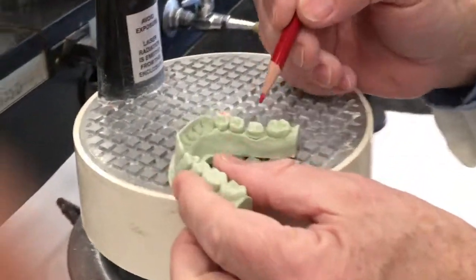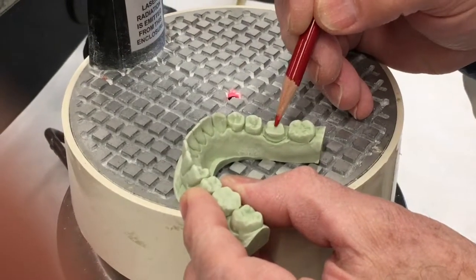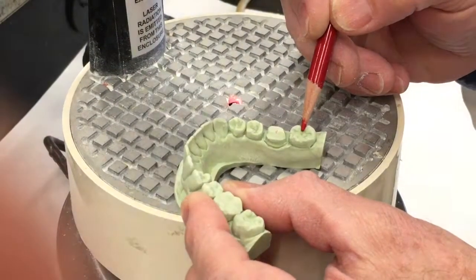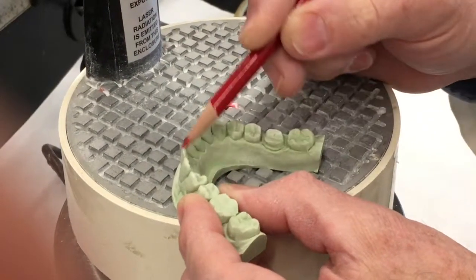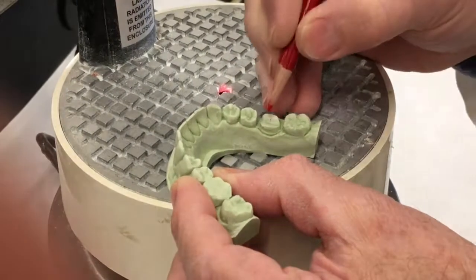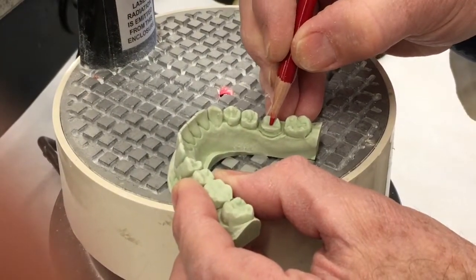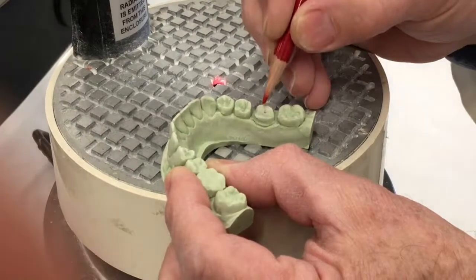We need to have a removable die here, so I'm going to need a pin here. There's a removable proximal contact here, and I need some pins to hold this last section together so it's all removable. So I'm going to put one right here, in the middle of my die, between the buccal and lingual margins.